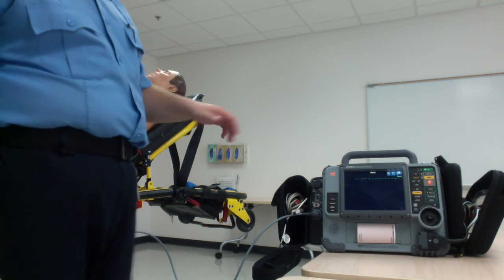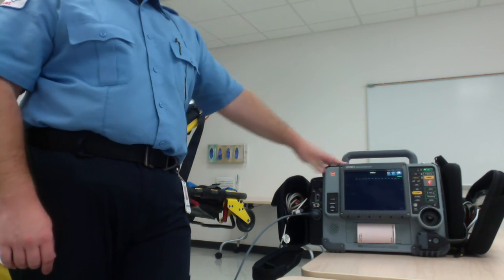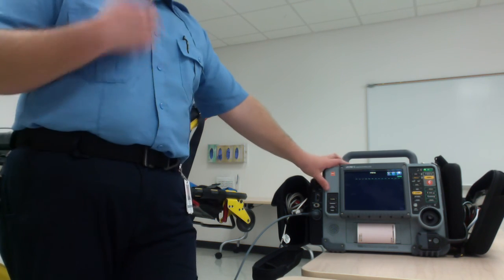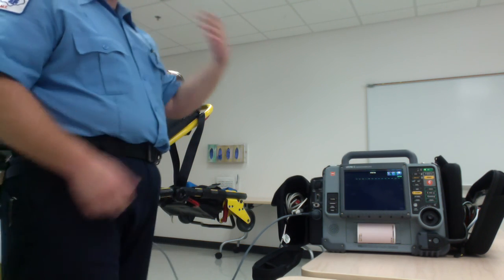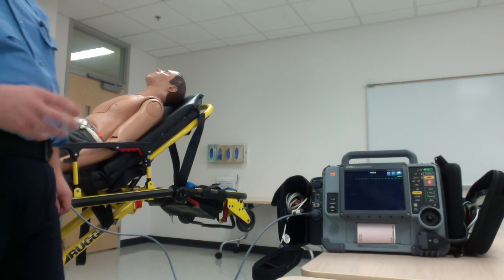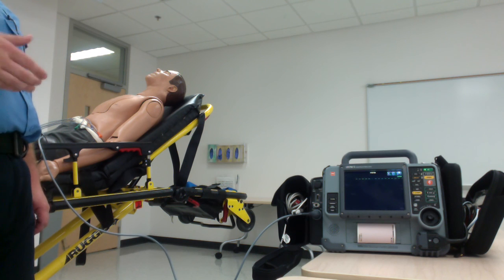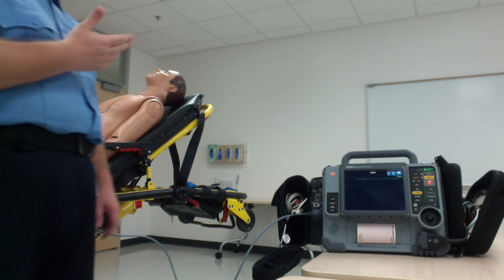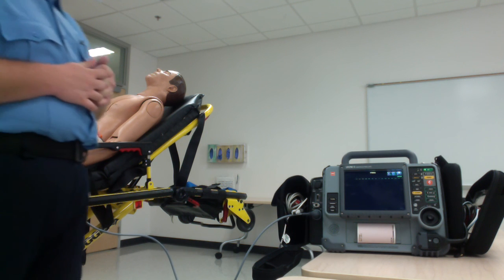The nice thing about these monitors too, all your modern monitors, is they have a way to transmit. So say, for example, you're just a basic service and your ALS crew is a ways out. You can say, okay, I don't know what's going on here. Go ahead and transmit this. You can transmit it through Bluetooth to a MiFi modem if you've got one in your truck, or a cell phone, whatever else. There are a number of different ways to transmit this to the hospital. Then your ER doctor can pull it up, look at it, and say, okay, this is what's going on. You get on the phone with them and say, hey doc, I've got this patient, I just sent you the 12 lead. What's going on with them? What else do I need to do? Do I need to go ahead and fly them to you? What else needs to happen here?